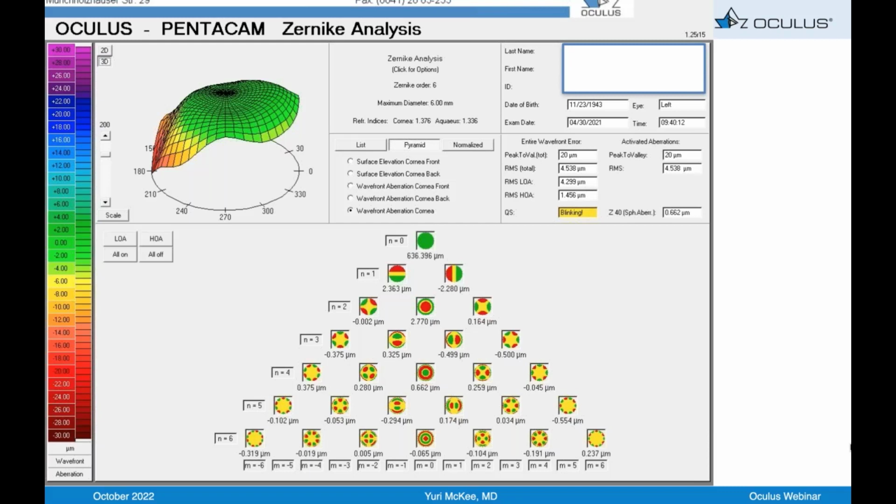I'm not doing a multifocal lens in this eye. With a gun to my head, I might do an EDOF lens, but I'd probably convince this patient that something like a light adjustable lens is the better way to go, just for vision quality and the possible refractive error we're going to get, because this cornea may not follow the rules that are written for IOL calculations.